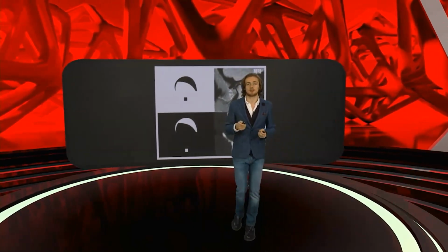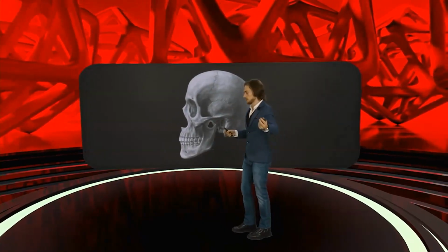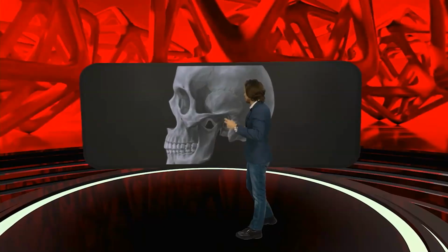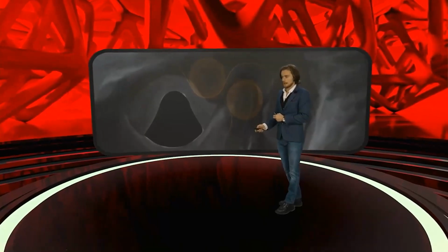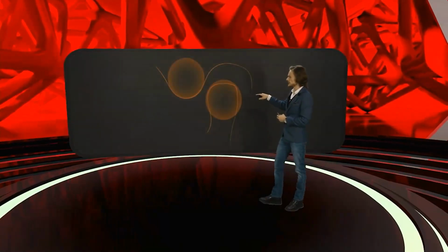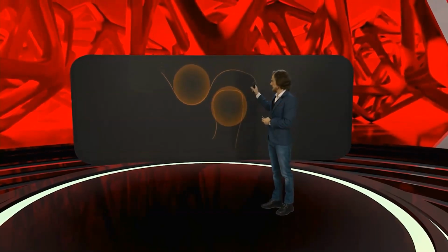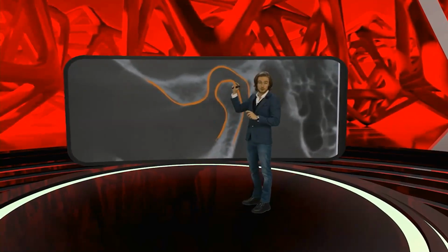So coming back to our CBCTs, when you look at this skull and you look from this perspective, this is the sagittal perspective. When we go a little bit closer, we see the condyle, you see the eminence. And when you look deeper in it, so this is double convex structure because the eminence is convex and the condyle is convex. So this is why the nature gave us a disc to create a double joints, the upper one and the lower one. But let's not talk about a disc right now. Let's talk about the contours that we see in here.